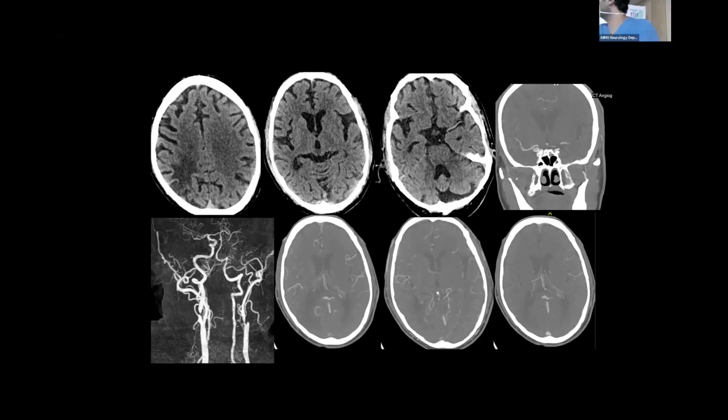Left hand. Sir, filling is from the opposite side, ACOM. Yeah, correct. I appreciate your answer, but the same side ECA. Okay. So the left MCA is seen, terminal ICA is also seen, probably filling through collaterals from the opposite side, or even through ECA collaterals it could have filled, or from PCOM also.